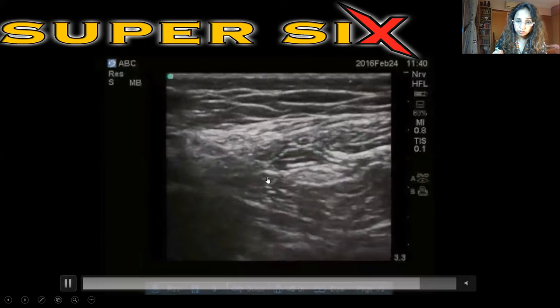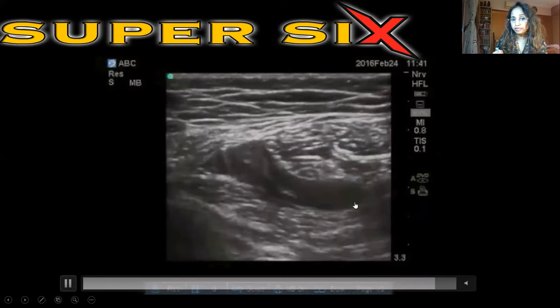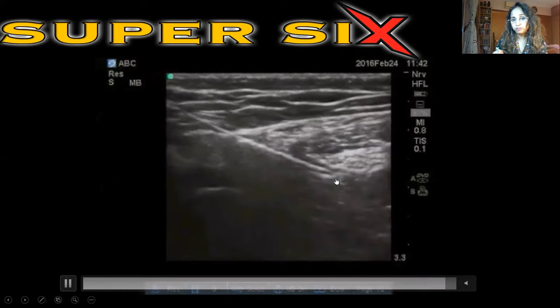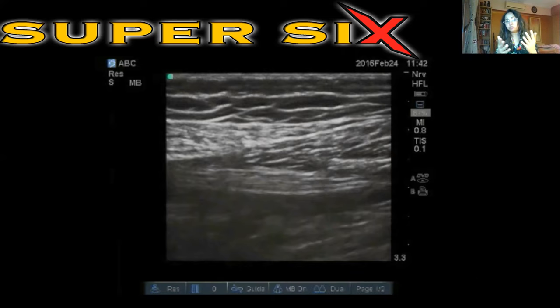Sciatic, so this is the sciatic nerve. This is the local anesthetic all around. We can even put catheters here. This is the catheter coming out, you can see the catheter and the Tuohy needle that is used, the longitudinal section of the sciatic nerve, and you will see the catheter walking along. So these were just glimpses of what is possible. These are the most common blocks that at least we use in our practice.